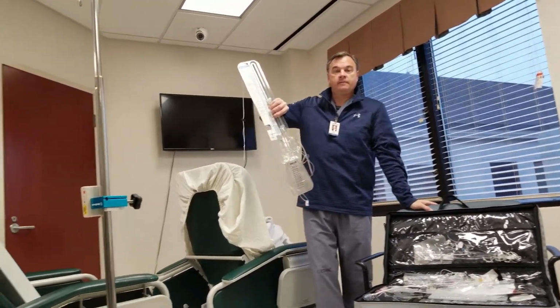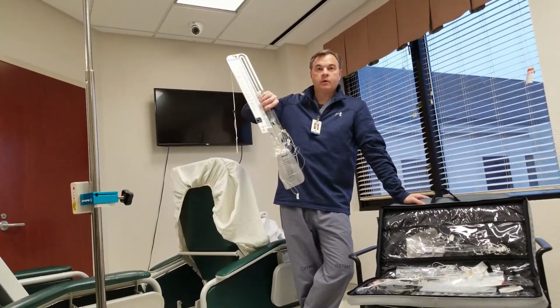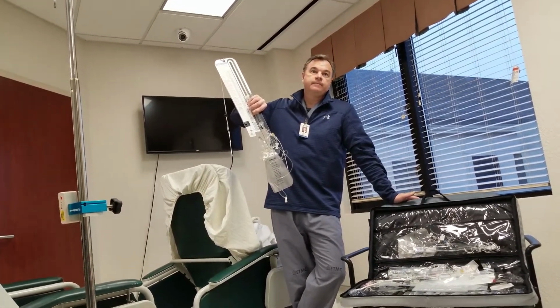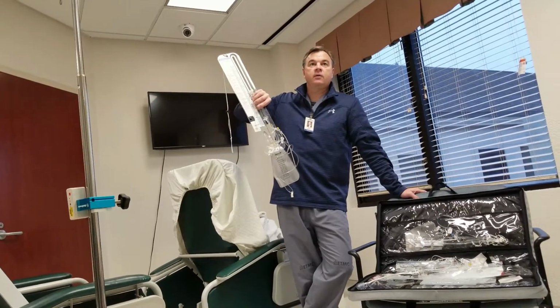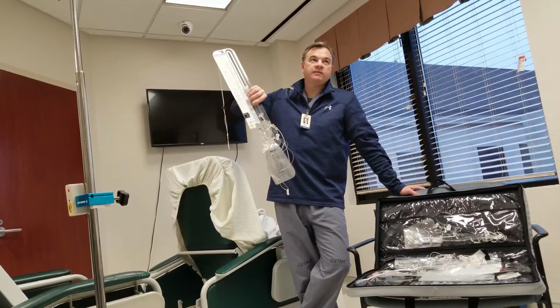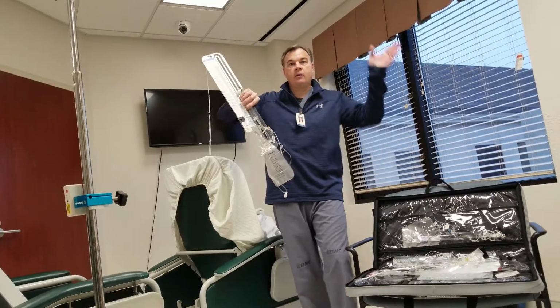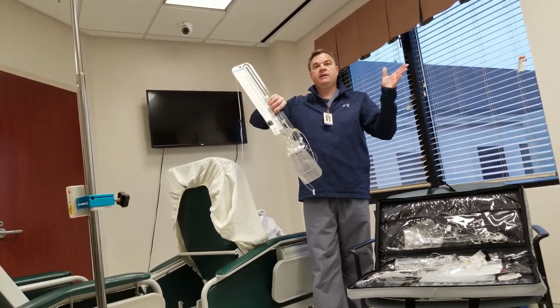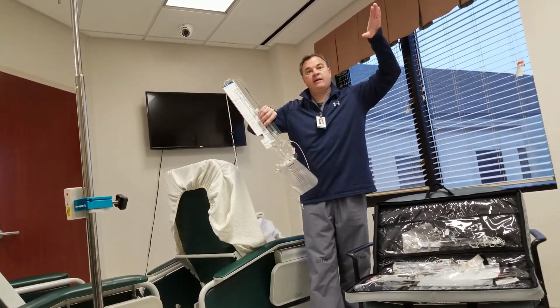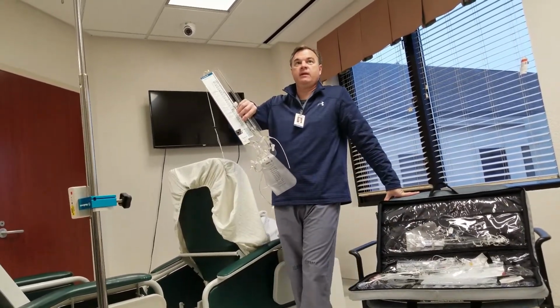There was one time I put out 11 cc in 1 hour. Okay, that's too much. So then you would try to raise the pressure? I think in that scenario, 11 cc in 1 hour, typically it's going to plateau out. Maybe she just had a spike, and it can't run like that forever, just by sheer volume. So usually you'll see it plateau out. I probably wouldn't be too alarmed at that.